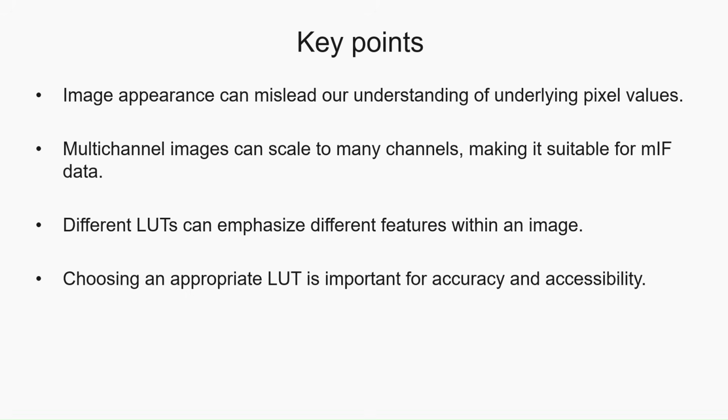And finally, choosing an appropriate lookup table is important not only for accurate interpretation, but also for accessibility and scientific communication. Keeping these principles in mind will help ensure that fluorescence images are displayed clearly, interpreted correctly, and communicated effectively in both research and clinical settings.